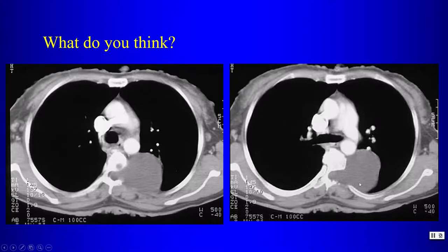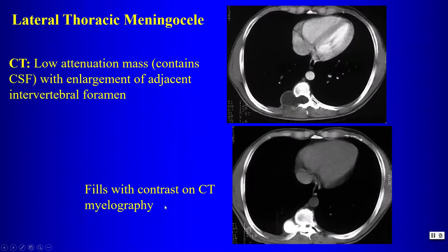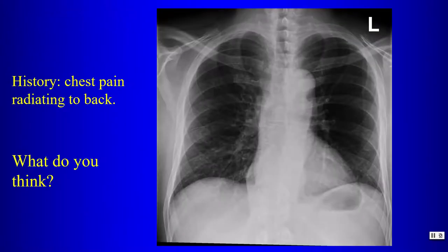A fluid-attenuation mass extending through the neuroforamina in a patient with skin lesions (neurofibromatosis): this is a lateral thoracic meningocele — anomalous herniation of the spinal meninges. Often associated with neurofibromatosis and scoliosis, occurring at the apex of the curve. The lesion is fluid attenuation because it communicates with CSF; myelography will show contrast filling the lesion.